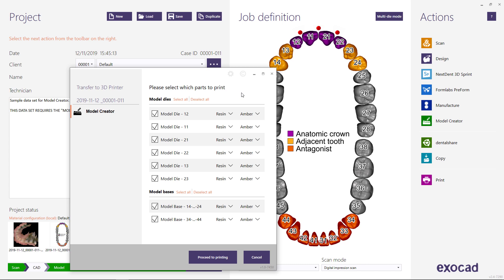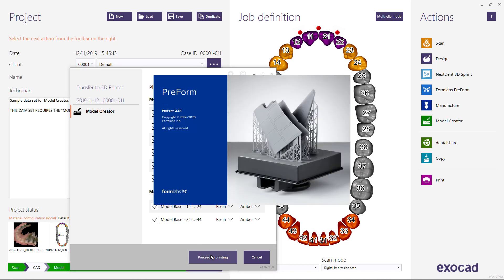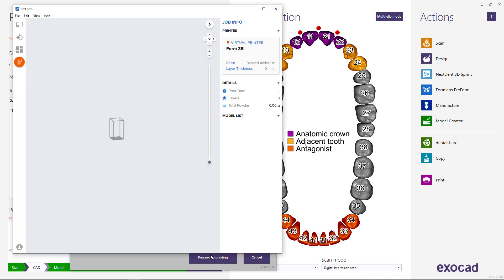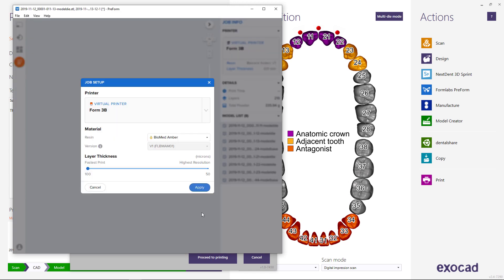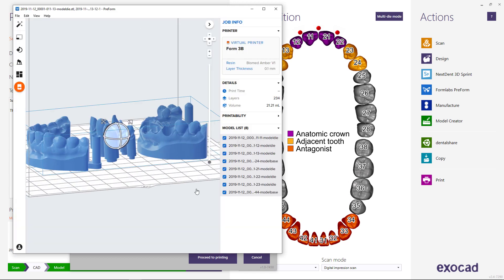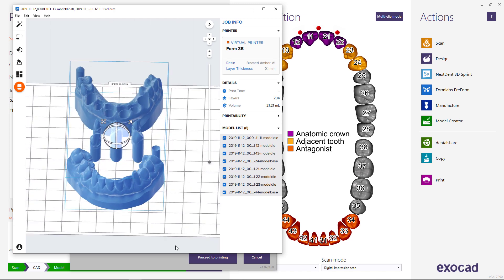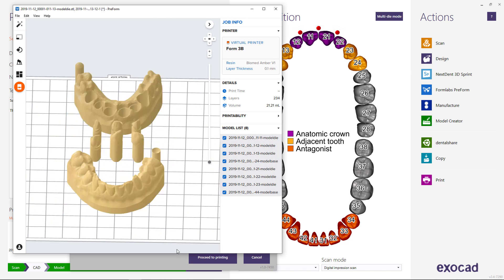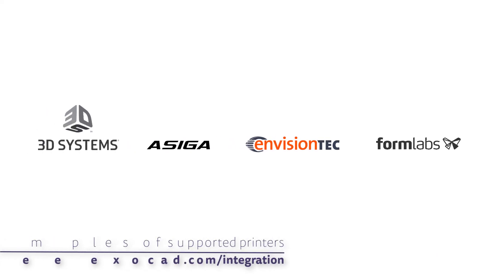You can open the printer transfer window and select the parts you wish to print. Provided you have a correct ExoPrint setup, models are loaded automatically and positioned in the 3D printer software. Please contact your reseller for ExoPrint setup and see our website for a list of supported printers.